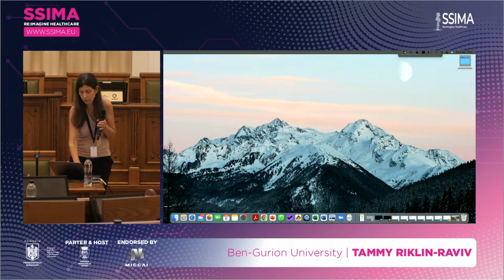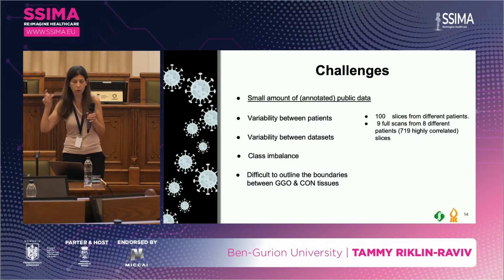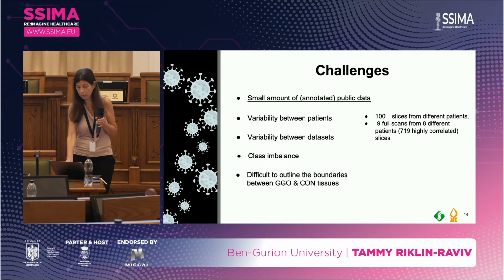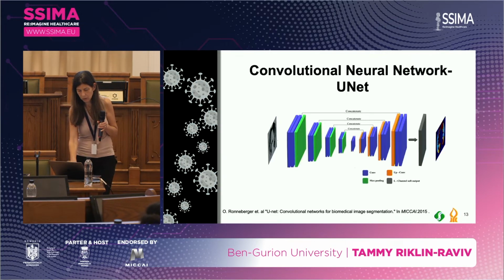And then we have volumetric data, but because of the strong correlation between consecutive slices, we couldn't use them for training. So we use them only for test. There is variability, as you may imagine. There is variability between patients.